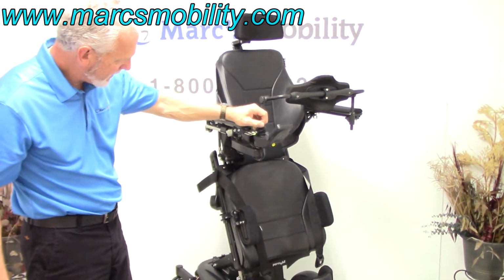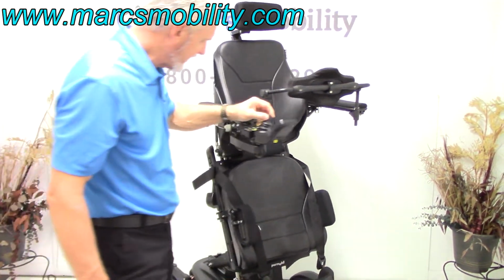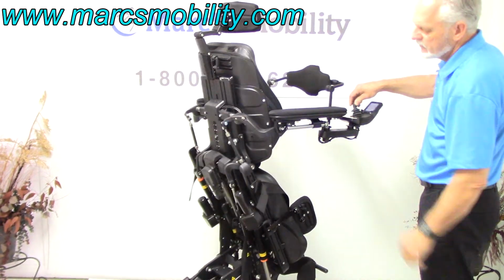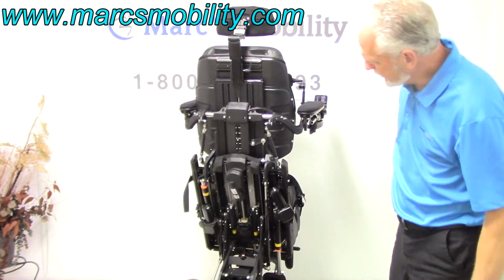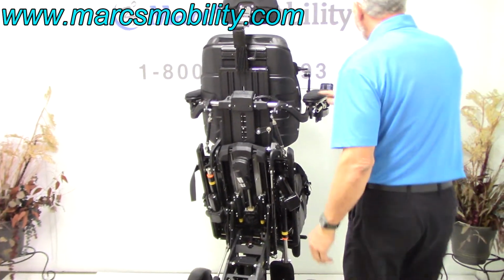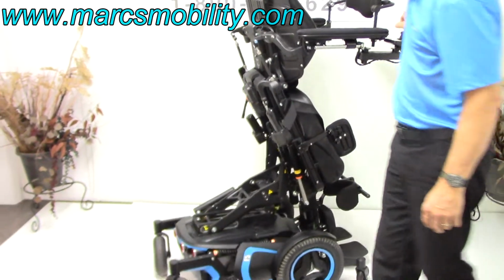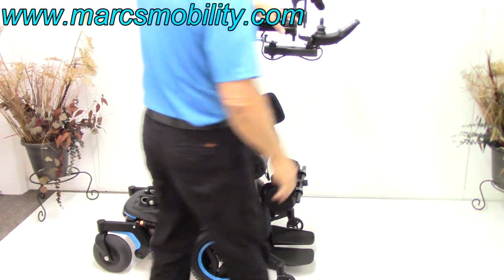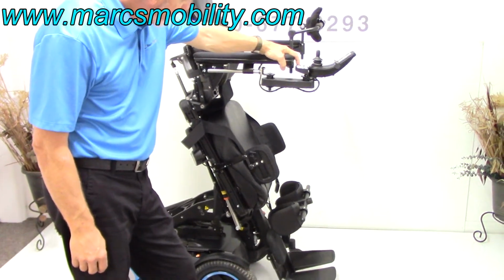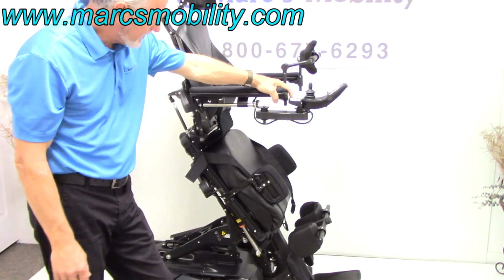So this is what you're looking at with a standing chair. I'm going to go in a complete circle with it so you can see the back of it while it's standing. So that's what you're looking at in the back while it's standing. So that is the electric standing position. And as I said, you can still drive when you're standing. So make sure when you do the standing position that you do your knee brace and you do your chest guard so you're well protected.